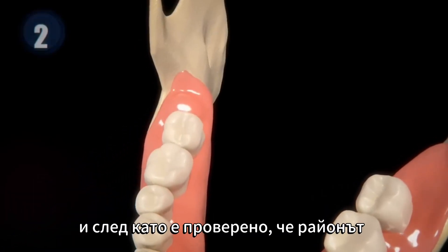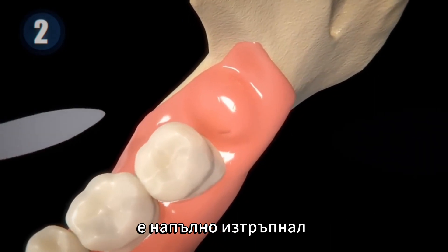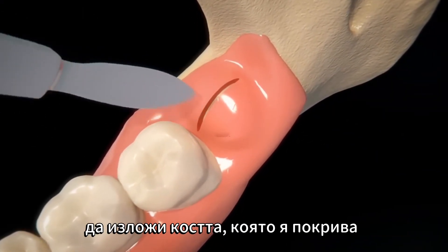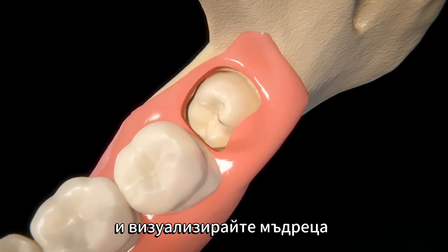Once it has been verified that the area is completely numb, a small incision will be made in the gum tissue to expose the bone that covers it and visualize the wisdom tooth.